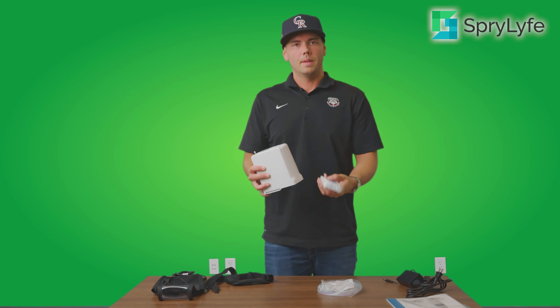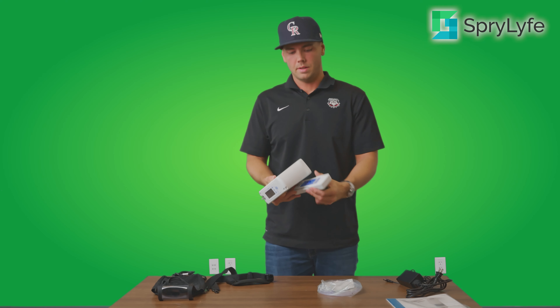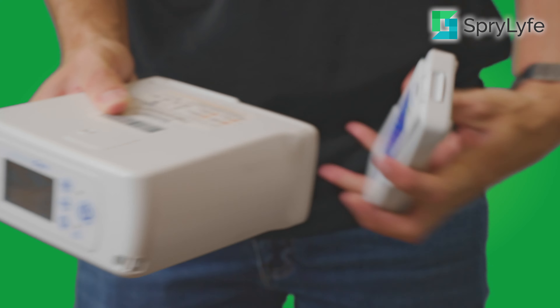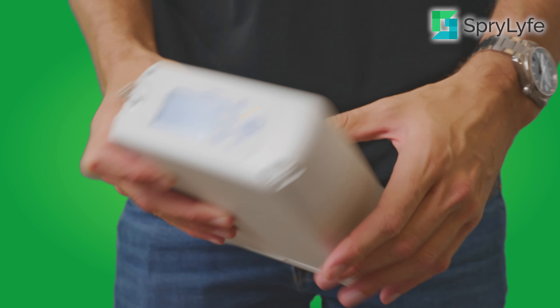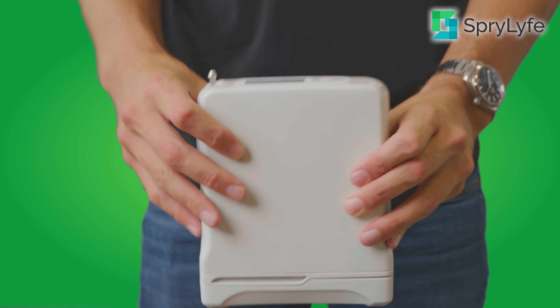Now that we've got everything unboxed, we're going to show you how to set up your Inogen 1 G4. It's pretty straightforward — you have your Inogen 1 G4 and then your battery, whether it's the four-cell or the eight-cell. You're going to slide it on; it's got some tracks on the unit. You'll hear it click into place, and the machine will give you a beeping noise once that battery is fully connected.